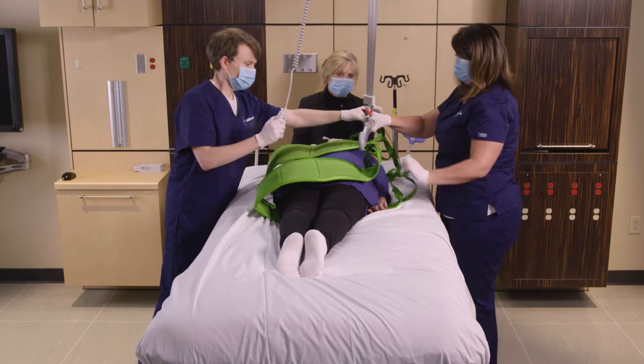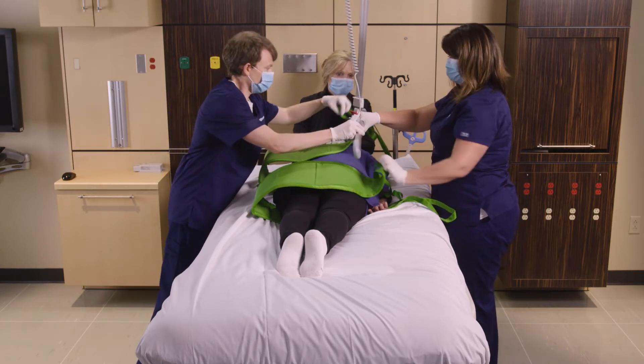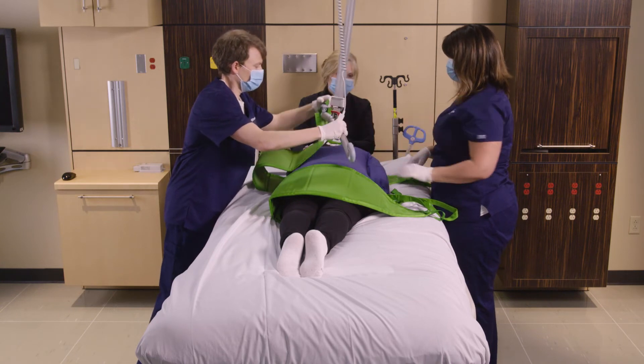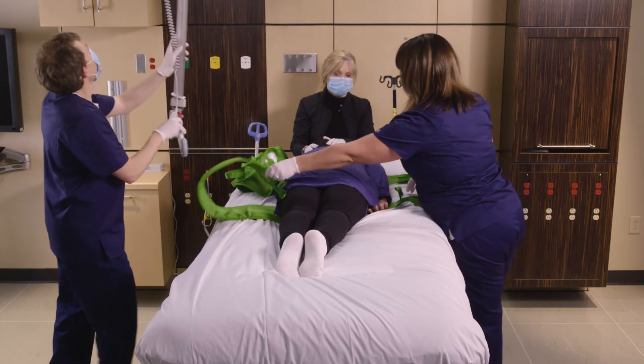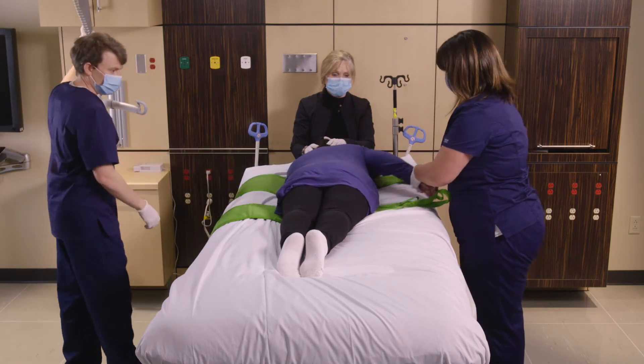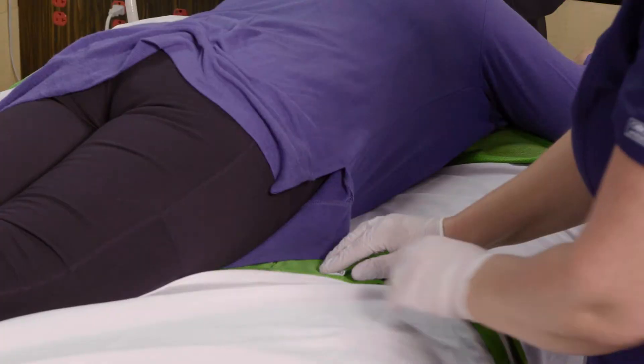We're then going to disconnect the loops of the straps, and then we'll simply remove the multi-straps and position the patient's limbs.